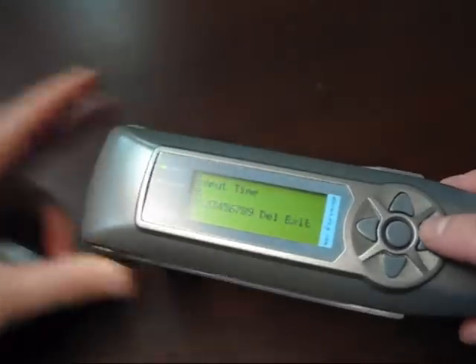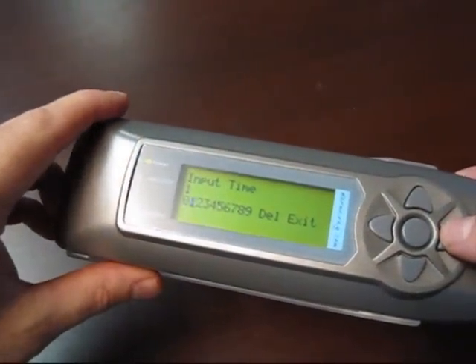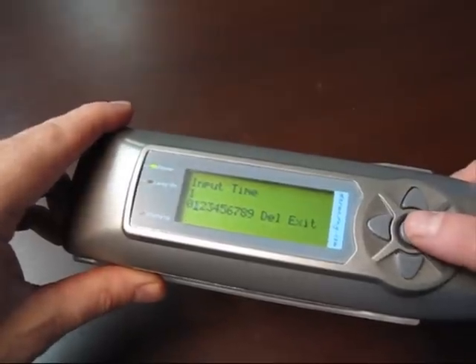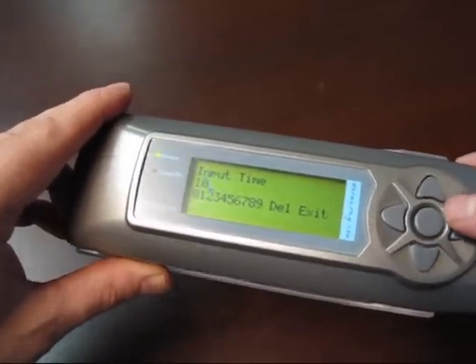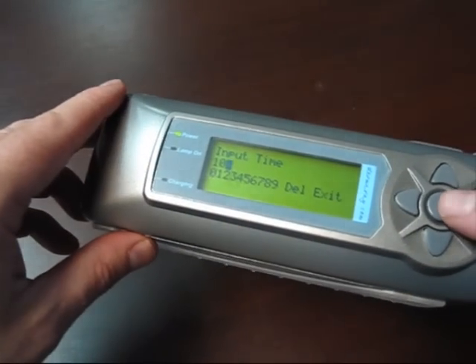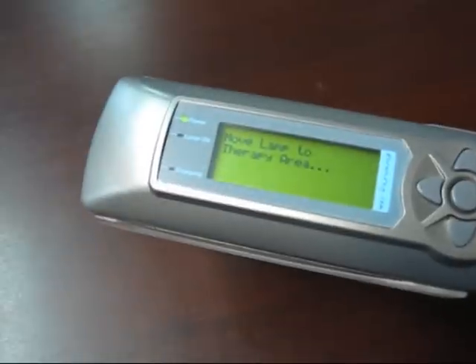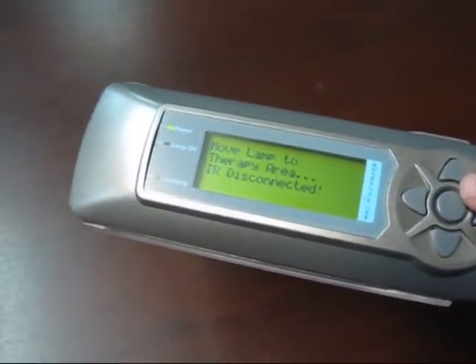And then, similar to entering the patient name, we want to tell it how long to stay on for. So if we do 10 seconds, pick a 1 and a 0. And you can either scroll down to the bottom to exit, or with the cursor at the top, you can just press enter. Now we've told the lamp to come on manually for 10 seconds and it'll turn off after that 10 seconds.